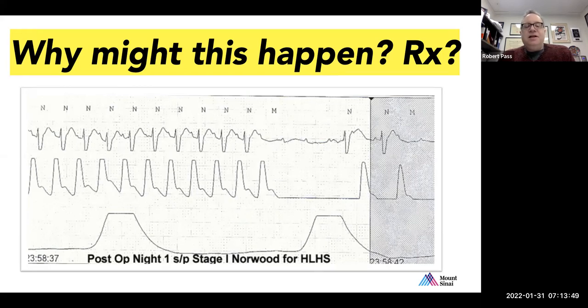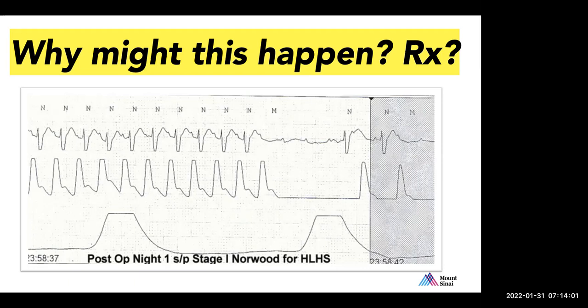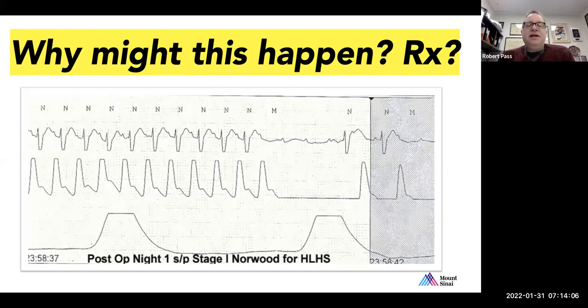In the old days, like say 20 years ago or earlier, it was very unusual actually to have dual chamber pacing in either permanent or temporary. In fact, the old temporary pacemakers did not even have atrial sensing as an option. So if you were going to dual chamber pace at a temporary bed space, you had to actually pace the atrium, at a rate faster than the intrinsic atrial rate. There was no atrial sensing choice on the old ones.